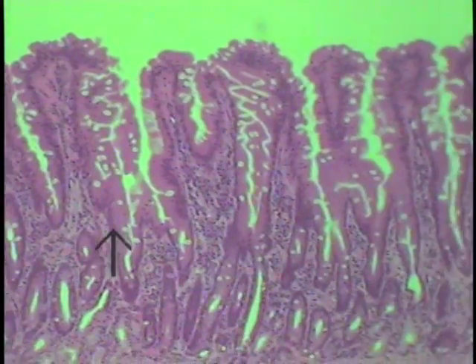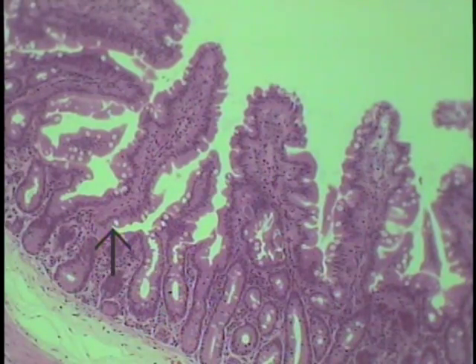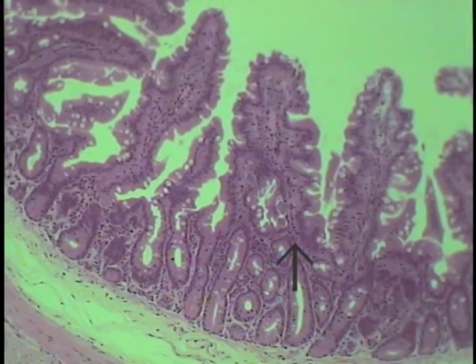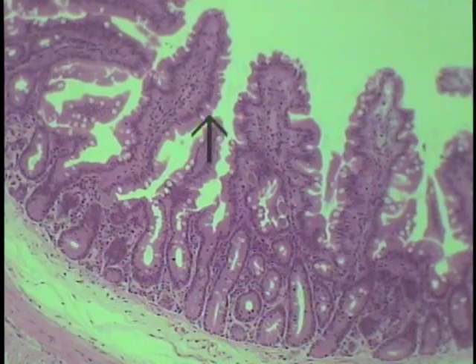So this gives you a feel for the number of these mucus producing cells, that is the goblet cells. This should be compared then immediately to the other segments of the small intestine, that is the jejunum and ileum. This now, in comparison to the duodenum, is a segment of the jejunum. Note that the villi perhaps are a little bit shorter and stockier, but this isn't obvious. The intestinal glands are perhaps a little bit shorter. But the most prominent thing to note is, examine now the intestinal epithelium and compare it to that of the duodenum.